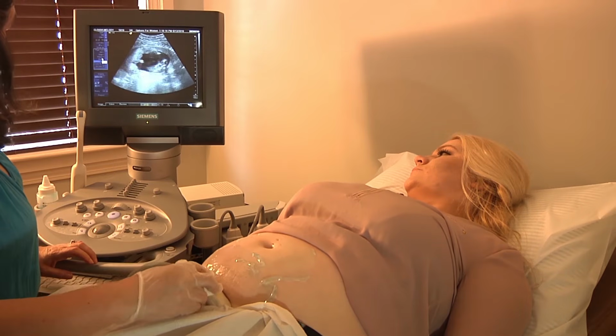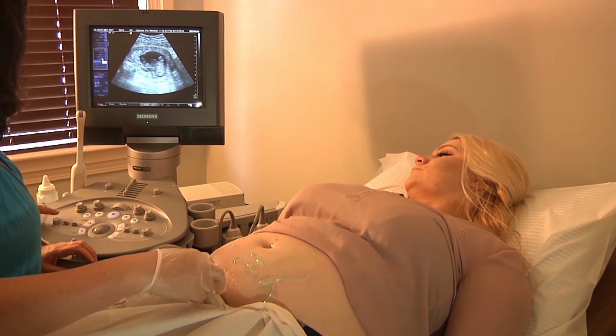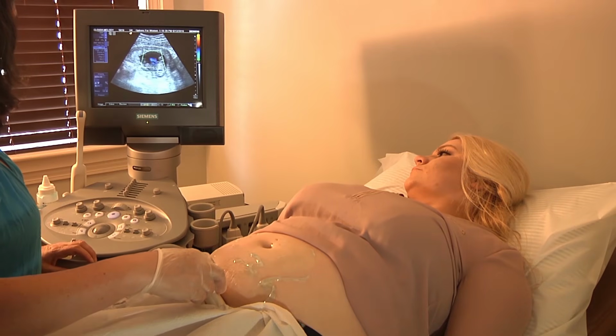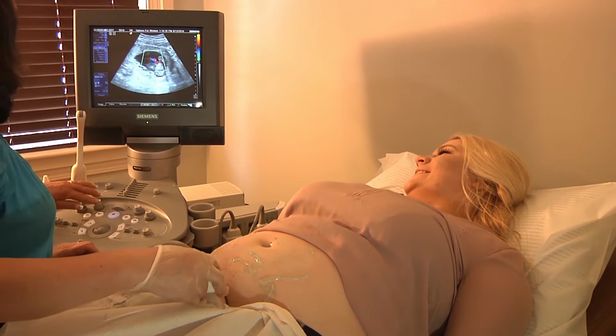Okay, now she thinks she sees the umbilical cord. Now, one thing you can do, I know you guys don't use your color, but if you ever question what something is, you can put color on, and that is the cord. You can see it pulsating. See it? Did you question it? No, I didn't. I just wanted to show them.